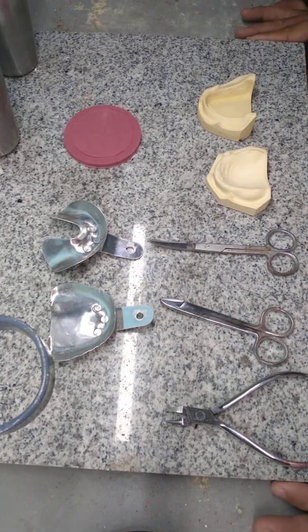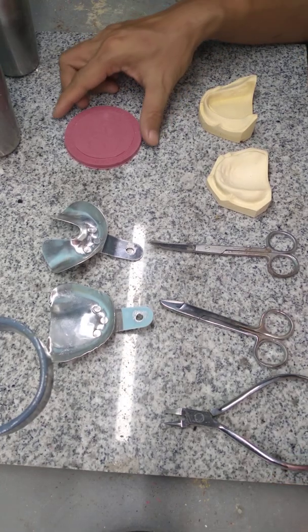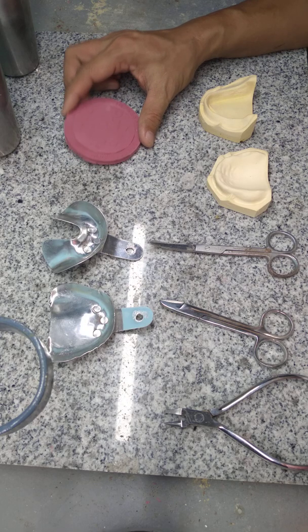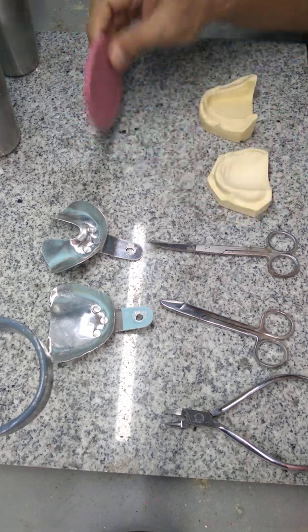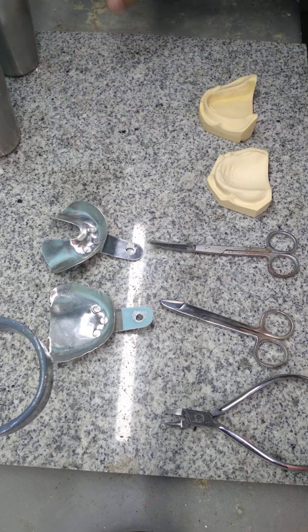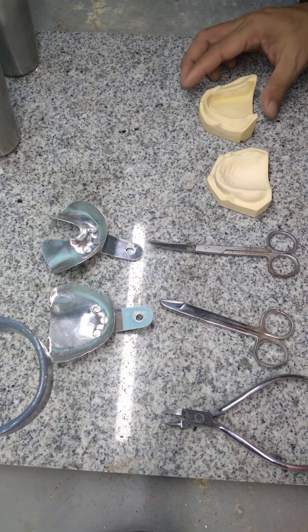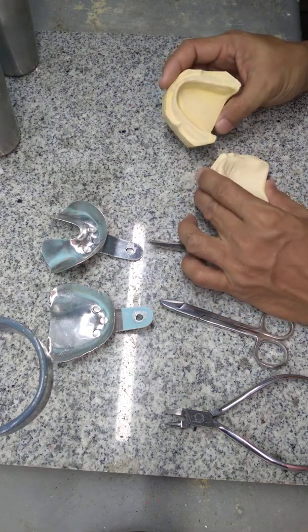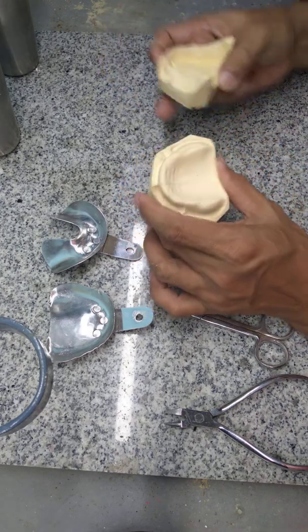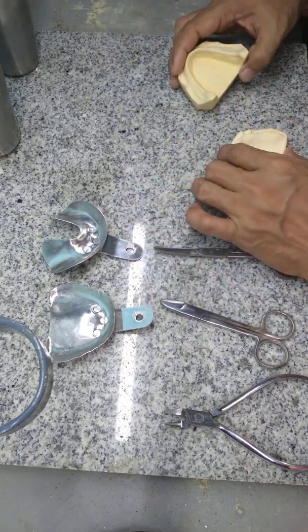Today we're going to do exercise number one: preliminary impression using modeling compound. But first, you need to review the anatomy of your edentulous mouth. Since we don't have a patient, at least review the anatomy of an edentulous cast.